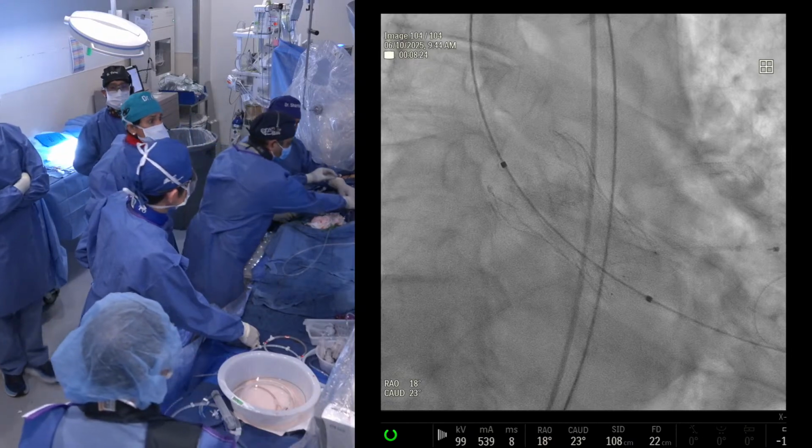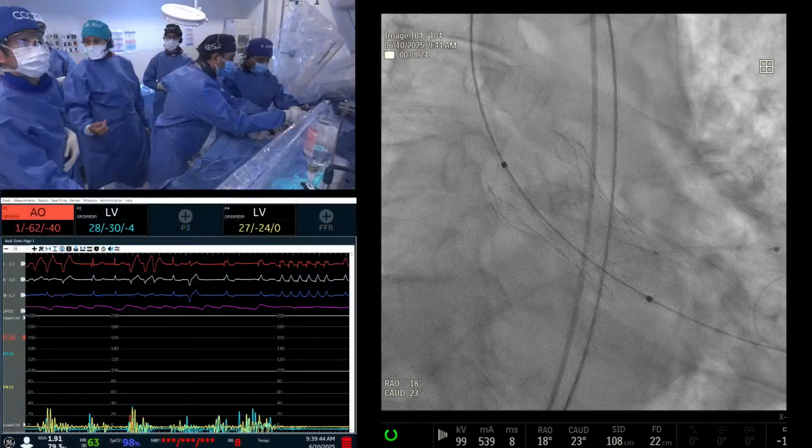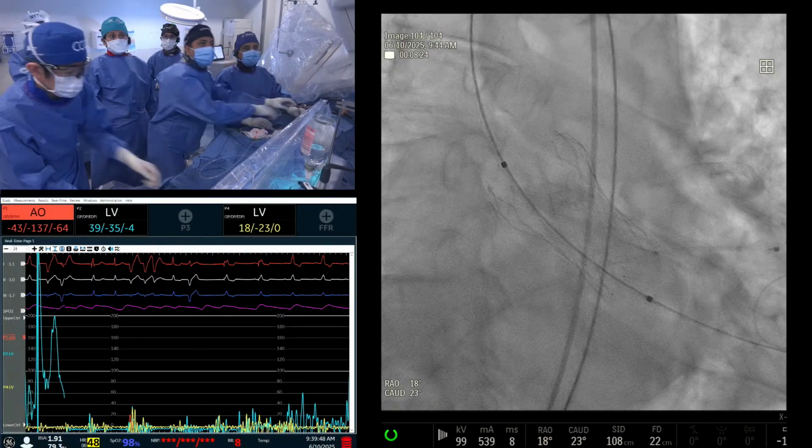So what we need to change is the transducer. I understand that there are still limitations with pure AR treatment. Okay, good, fine.